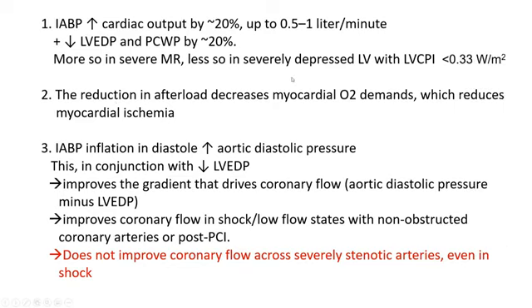Number two, the reduction in afterload decreases myocardial O2 demand, which reduces myocardial ischemia, and that's a major effect by which balloon pump improves myocardial ischemia.